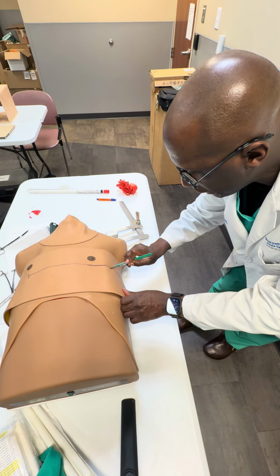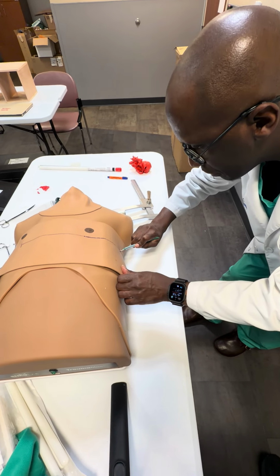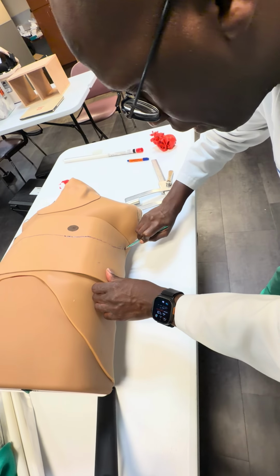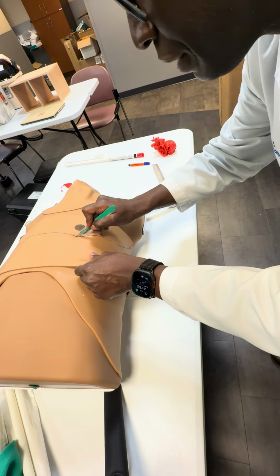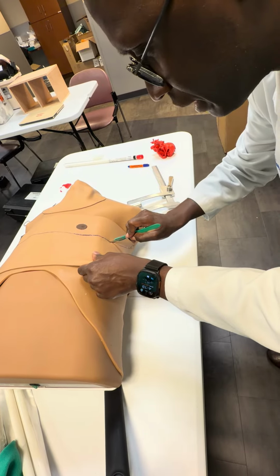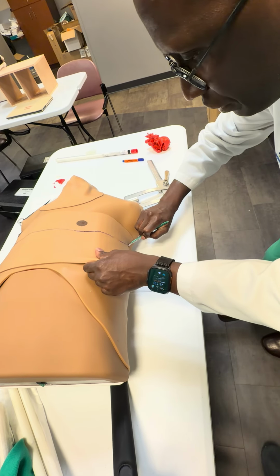So as I get to the anterior axillary line, I want to curve my knife to follow the intercostal space. The ribs curve as they go to the axillary space. Oftentimes you don't get this all with one pass, so I'm going to use that same line. Again, I'm trying to get through skin, subcutaneous tissue, and intercostal muscle with this.